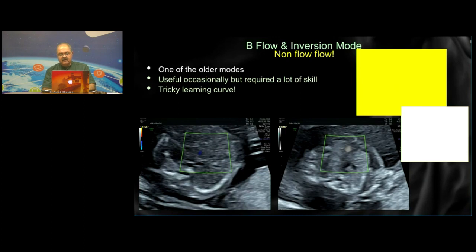But what the equipment does is realize that these are echoes that are not moving and that they will move ultimately, and that we will get an answer in terms of what is going on. So in that situation, we say, yes, we will reconstruct anatomy with the flow void, much as we do in MR. And then we realized that, yes, we were moving in the right direction.